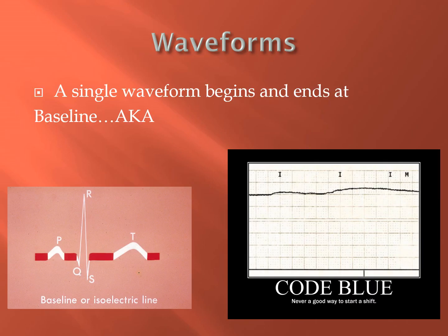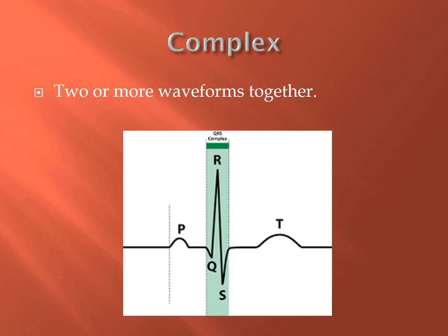Waveforms: a single waveform begins and ends at baseline. So it begins at the isoelectric line and ends at the isoelectric line, right? It begins and ends at a baseline.